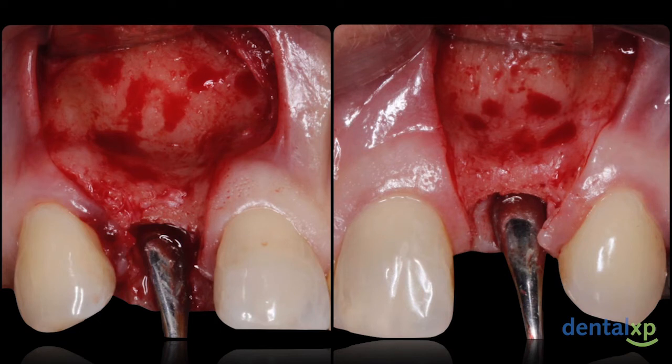So the sites were accessed, and in this case we had a papilla-sparing incision design. These designs have a little bit of controversy regarding them. They do have the advantage of not involving the attachment of the adjacent teeth, so it reduces the chance of having any papillary recession in the area. But for these types of augmentations, it may not be the best choice, as the incisions may end up over the augmented site, and it also has a small base which may not give adequate blood supply to the flap or the crestal portions and may increase the risk of exposures of these blocks.